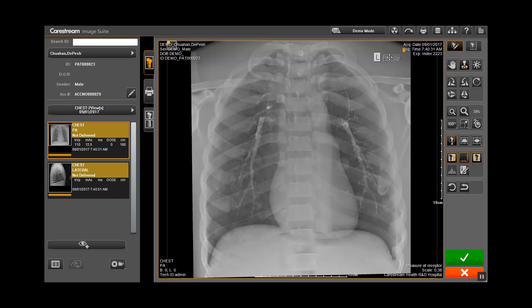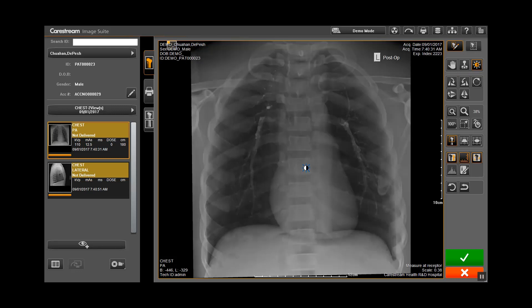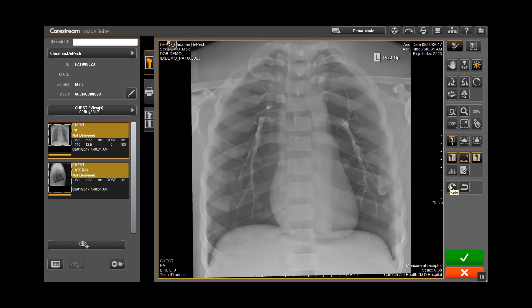To change brightness and latitude on the image, click on the brightness icon. Click and drag the cursor across the image to change brightness and contrast. Click on the undo icon to undo the last change, or the reset icon to reset the image back to where you started.